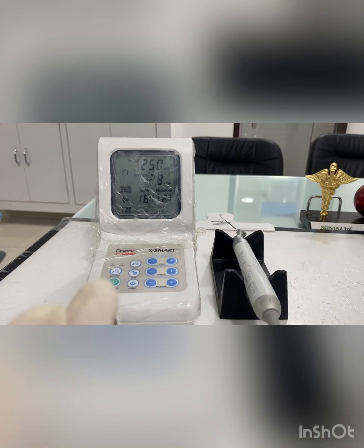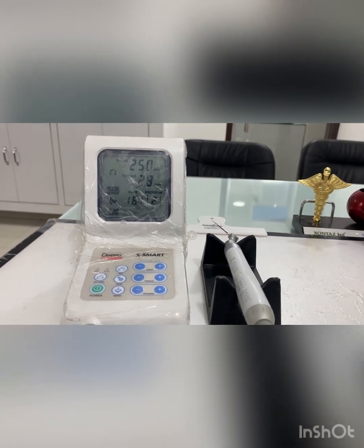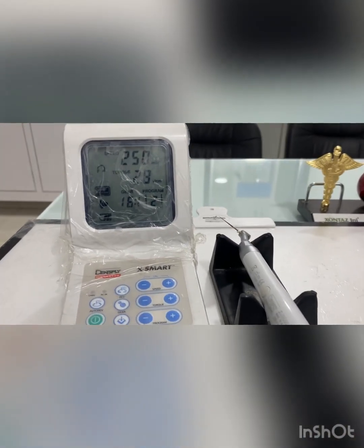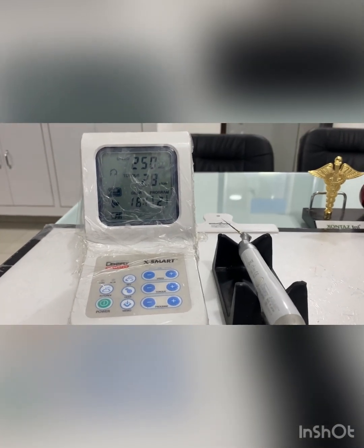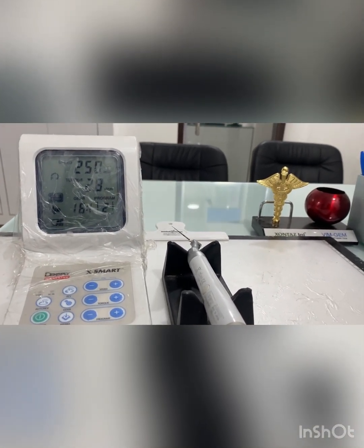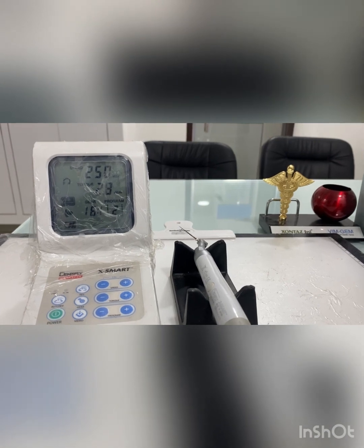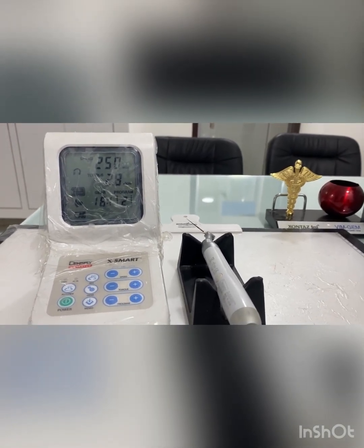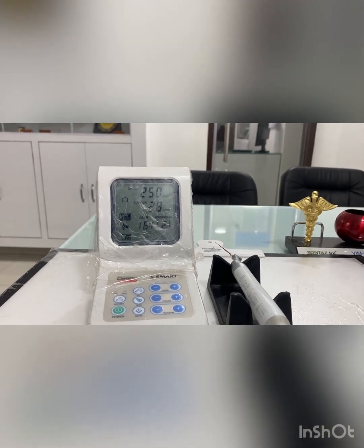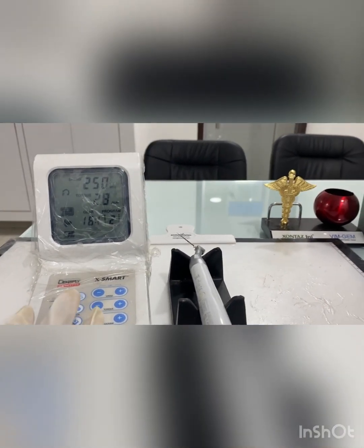There should always be a balance between speed and torque. If speed is too low, cutting efficiency is reduced; if speed is too high, there are more chances of file fracture. In severely curved canals — for example, a molar with a very curved canal — there is a lot of binding, and if torque is very high, the file will fracture as soon as it binds.